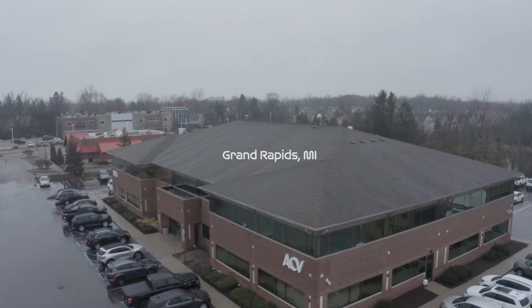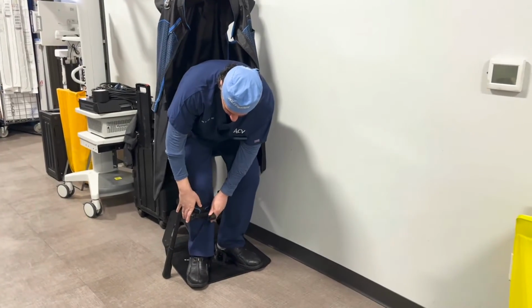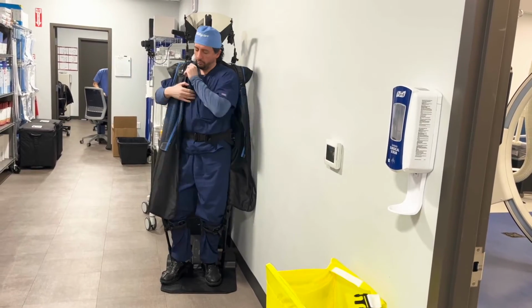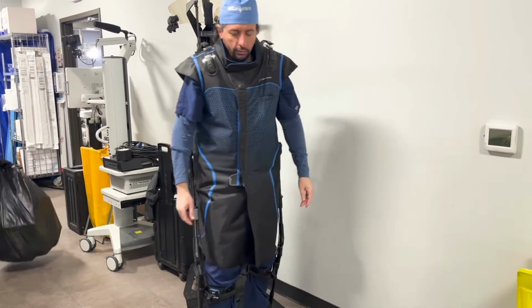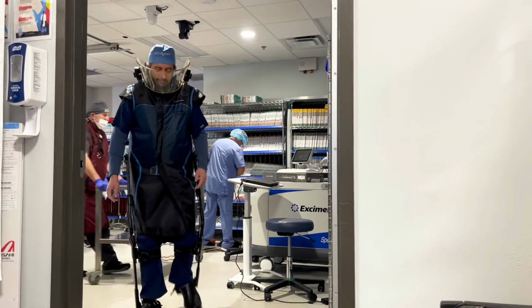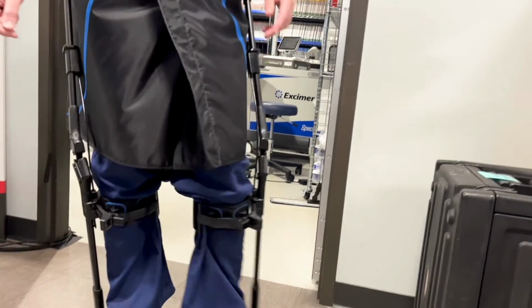There are other technologies right now that are available that would alleviate the weight, especially the lead weight, off of the physician. The problem with these technologies, I mean, it's a great step forward, but the problem is it does not take into account the need of physicians for mobility. So it works in certain situations, like when the physician does not need to move.